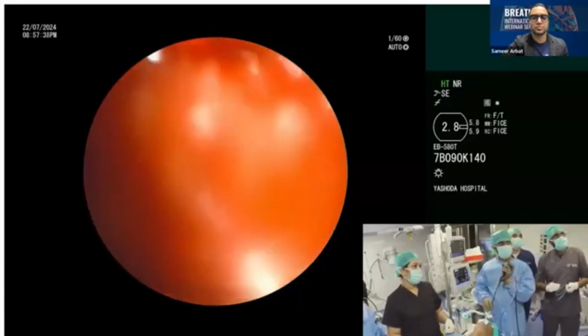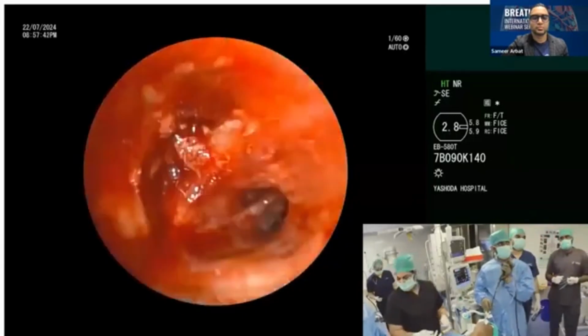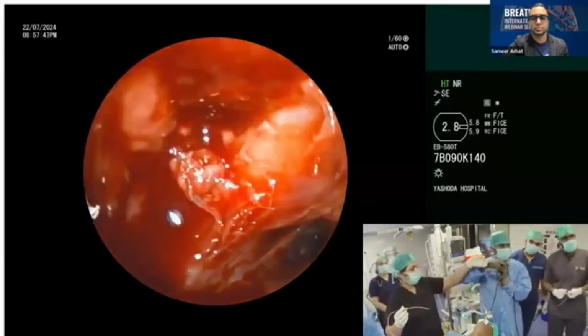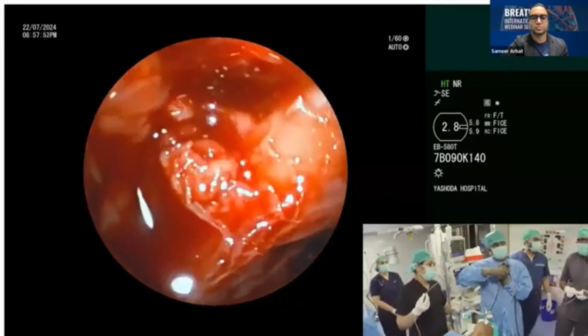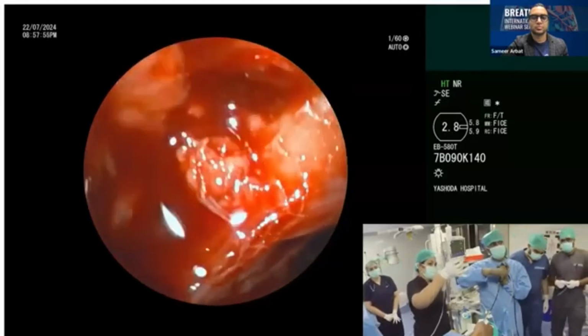Now, once the tumor is completely removed, most of the tumor is removed, and I am able to attain a functional efficacy. Now, what I'm going to do is I'm using an electrocautery tip, and in certain cases, you can even use an APC to attain local site hemostasis, so that the tumor stops bleeding, and you are able to extubate this patient on table.